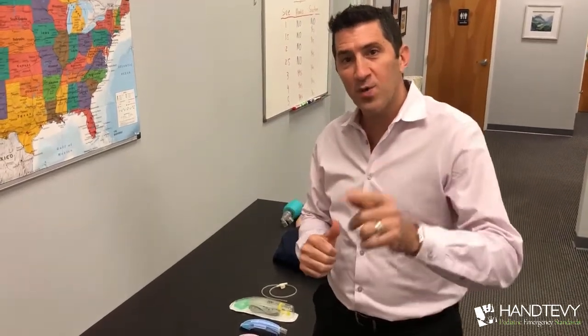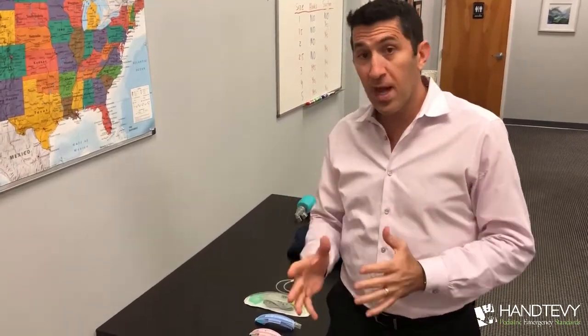Hey everyone, this is Dr. Peter Handtevy. Welcome to another edition of the Handtevy Minute. Today I want to talk about an airway, specifically the supraglottic airway. Now as you know, I love the BVM — basic BLS maneuvers are important — but once you start to advance the airway, consider a supraglottic airway.